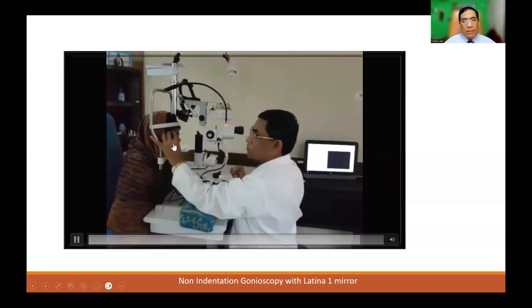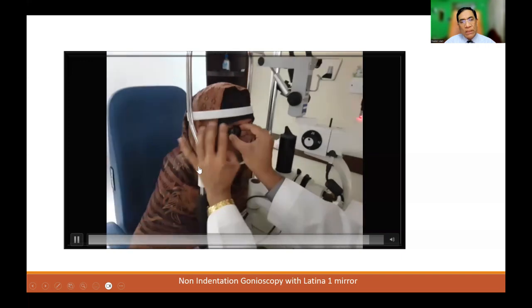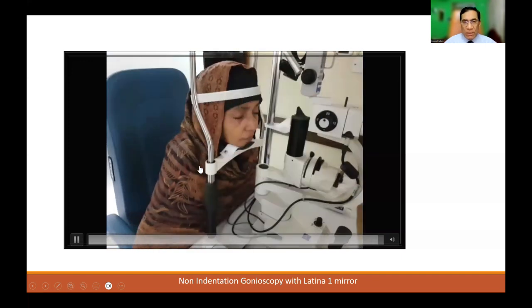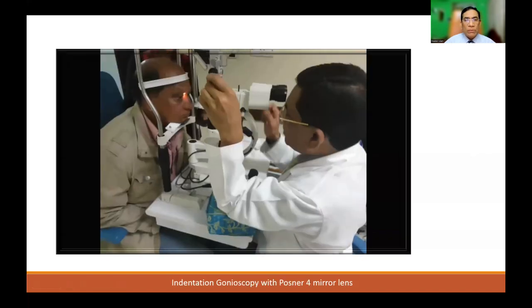And when you finish, you very carefully observe here that I'm holding it, then placing pressure on the lower lid, then coming it up. Otherwise, because of the suction action, the patient might get pain. So it's very important to remove the lens carefully.